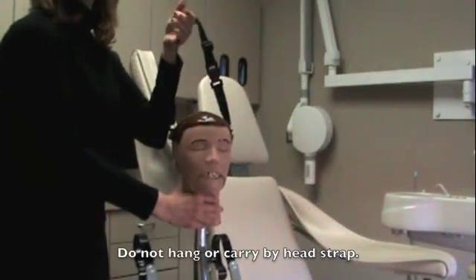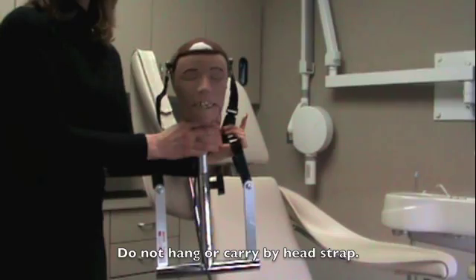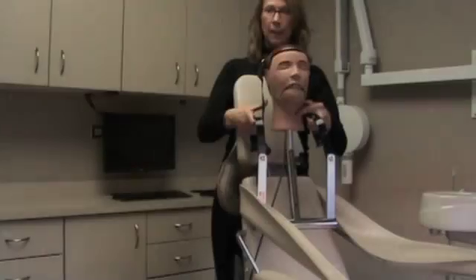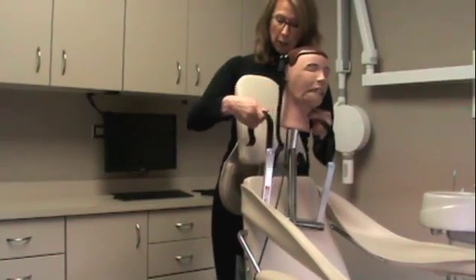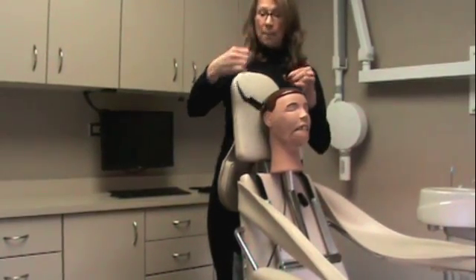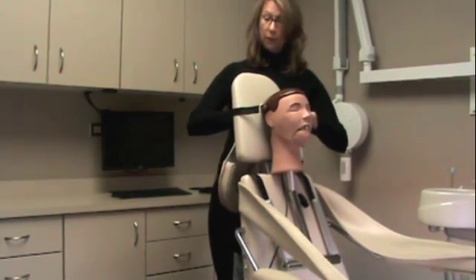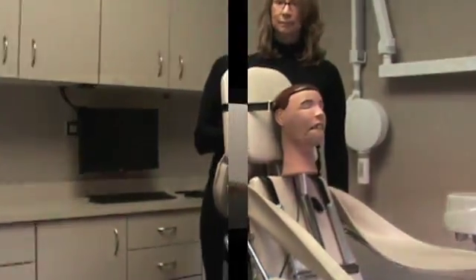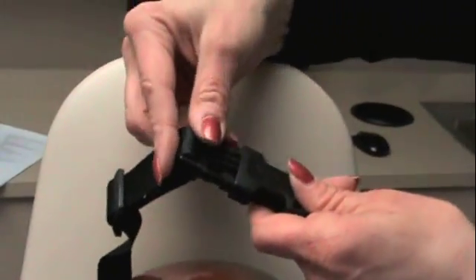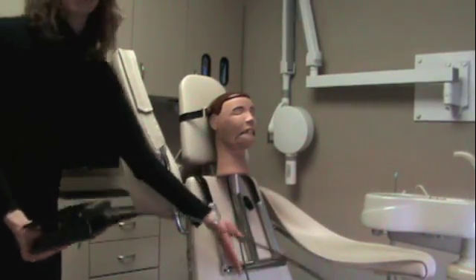Do not hang your Dexter by the strap — securely hold him at all times. Place your Dexter on the chair using the chair hooks as shown. Slip the head strap over the back of the chair and adjust so he's held firmly in place. Place your foot pedal at the base of the chair, ensuring that you do not kink the cord.